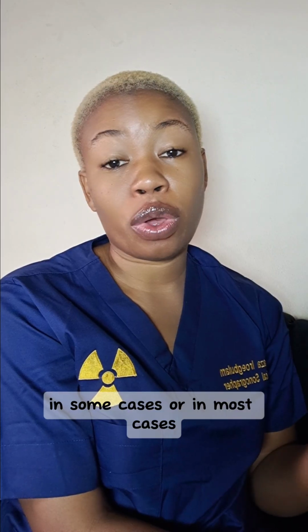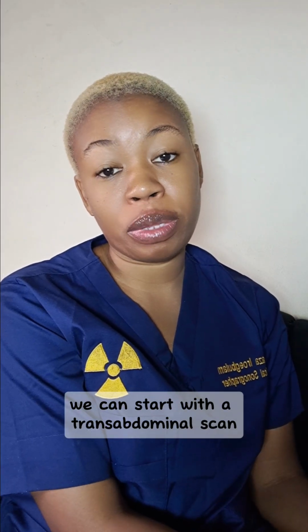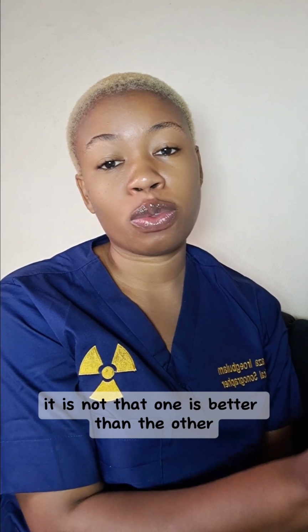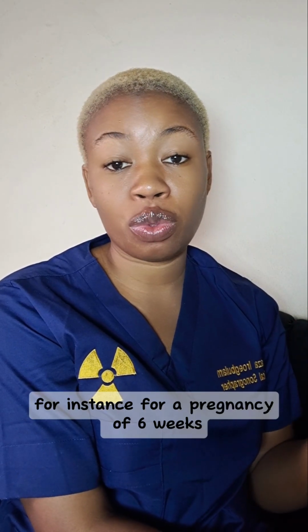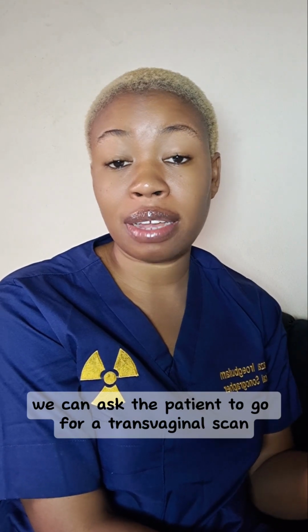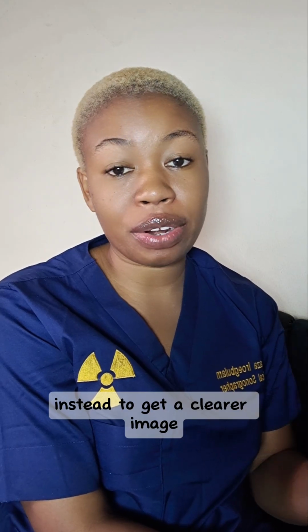In some cases, or in most cases, we usually use both. We can start with a transabdominal scan and then conclude with a transvaginal scan. It is not that one is better than the other. It is just that they both answer different clinical questions. For instance, for a pregnancy of 6 weeks, if we don't see anything using the transabdominal probe, we can ask the patient to go for a transvaginal scan instead to get a clearer image.